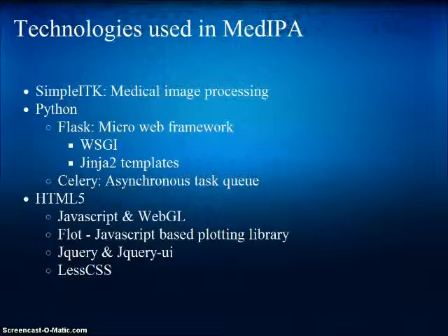One of the first technologies is a Python library called SimpleITK, which handles processing of the binary medical image scans to be output into a format that is Python readable and then can be manipulated by our own personal code.